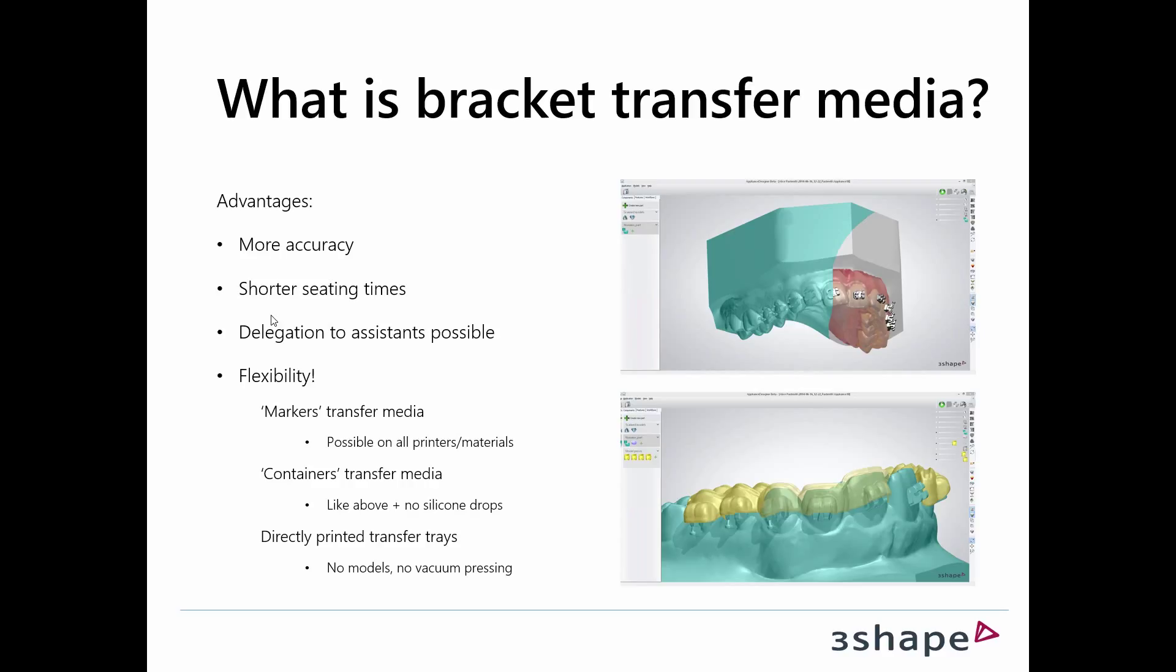Depending on which country you are in, there are different legislations. It offers a very high range of flexibility. What we call markers is a way where you can represent where the real bracket should be placed later on a model you thermoform on top of.